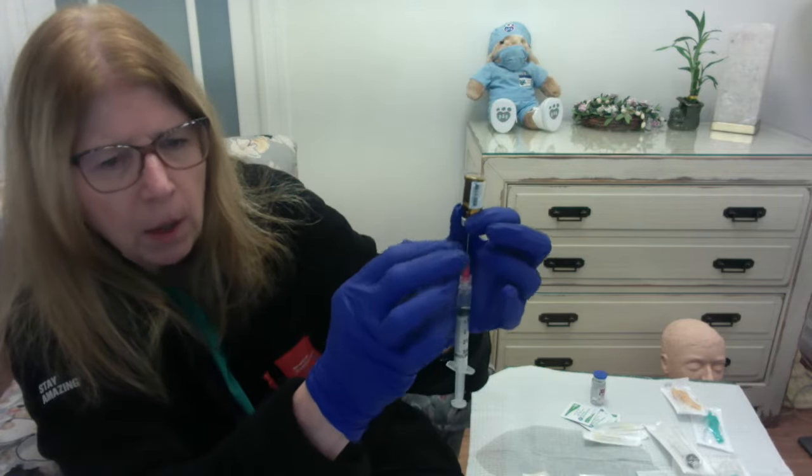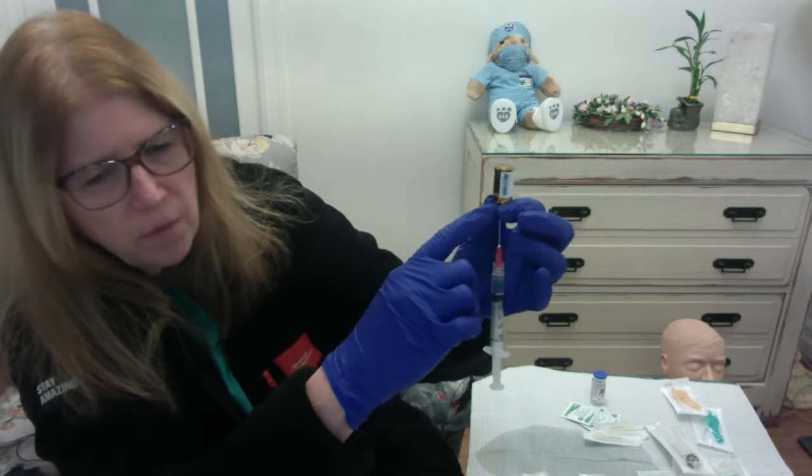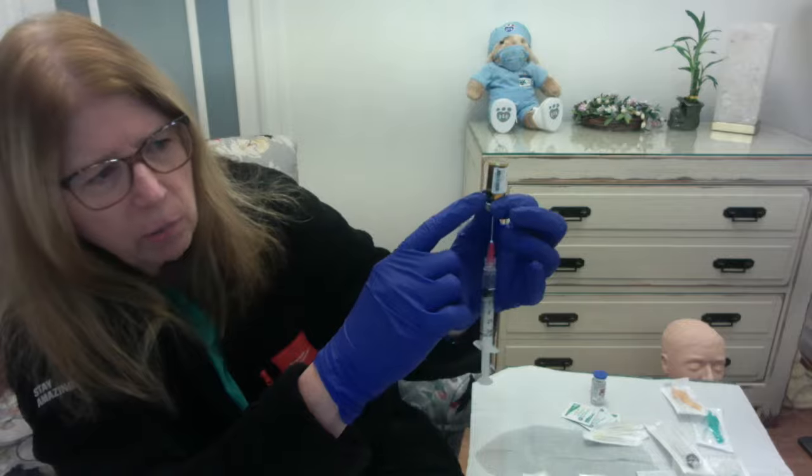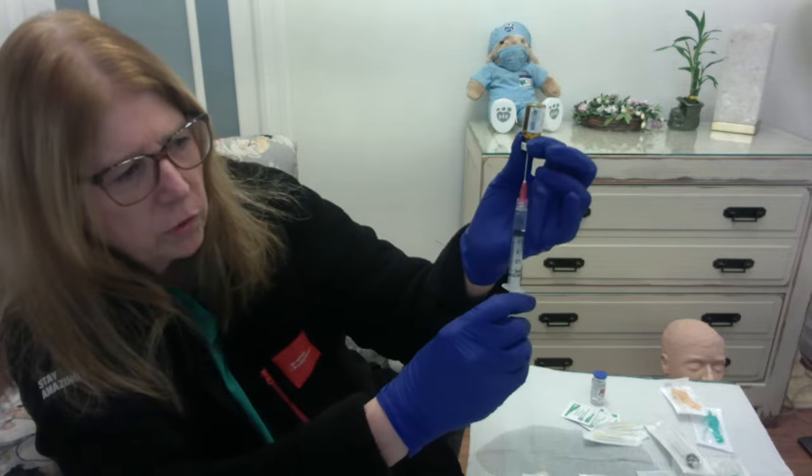Now one thing that you need to be cautious about is you see this little empty space where there's no label. We refer to it as a window. You want to make sure that the tip of your needle always stays below the level of the fluid. Otherwise, you're going to suck air into the syringe.